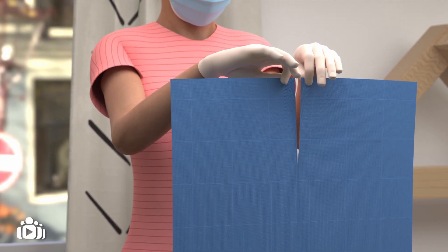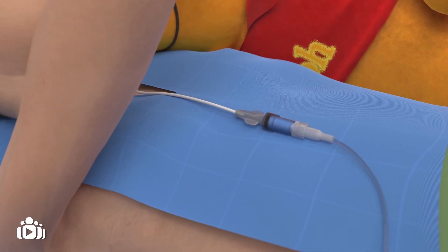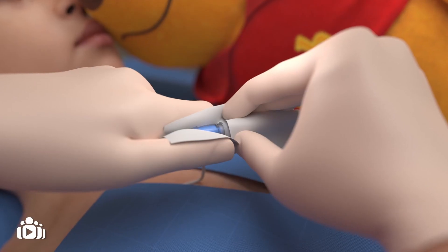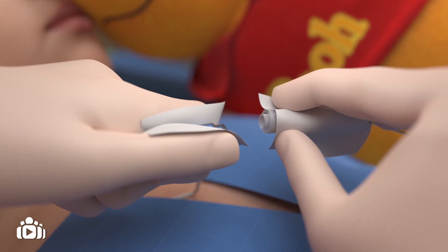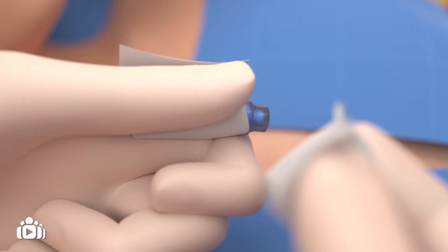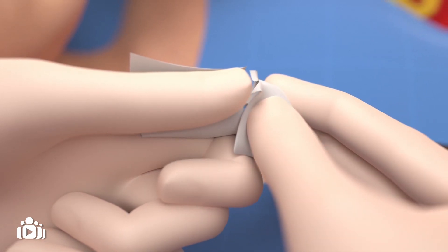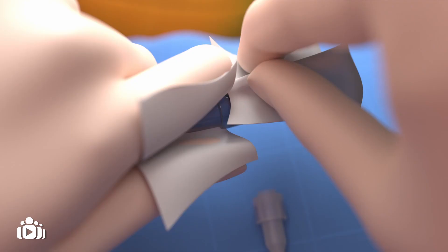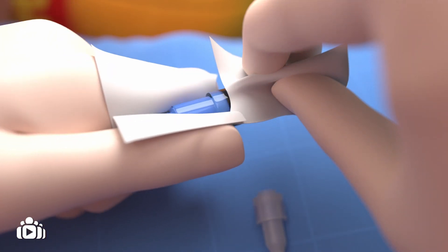Put a sterile sheet on the child's chest and rest the disinfected catheter hub on it. Hold the catheter hub by its fins with an antiseptic gauze. Open the valve of the catheter hub and disconnect the parenteral nutrition bag. If you are not changing the valve as well, disinfect it with an antiseptic gauze for 15 seconds. If you are going to change the catheter valve, unscrew the existing valve with an antiseptic gauze and screw a new valve on the catheter hub.